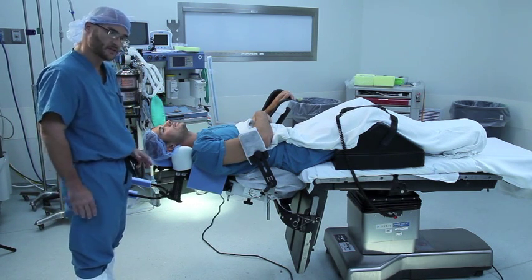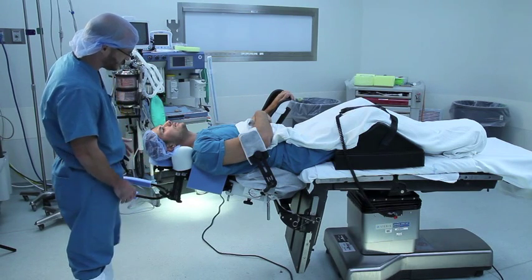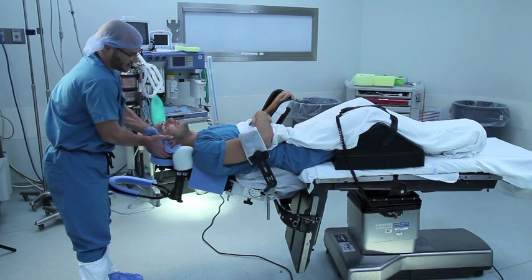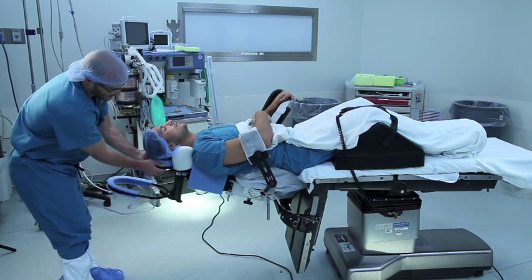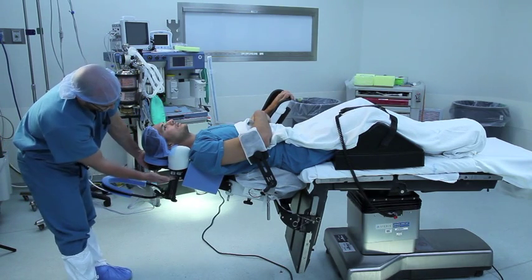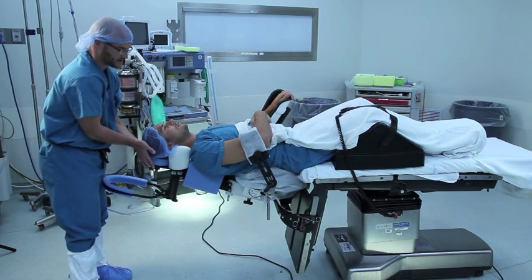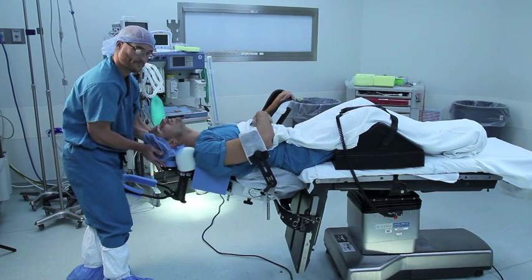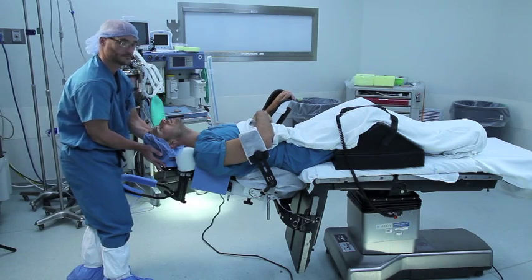Another thing that the anesthesia doctors often like to do is to rotate the head into this position. The sliding headpiece allows the anesthesia doctor to push and lift at the same time, achieving the sniffing position.